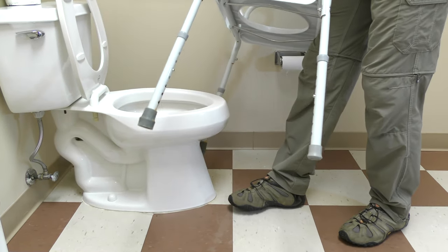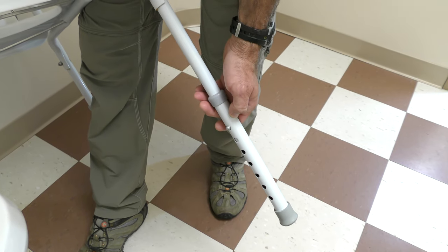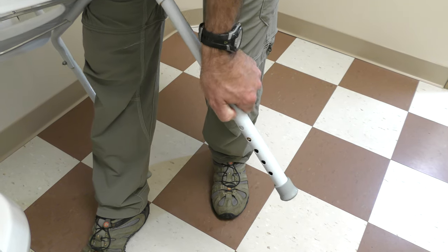Before your hip surgery, fit your toilet with a raised toilet seat or toilet chair. The toilet chair can be adjusted to different heights. Make sure all four legs are even.